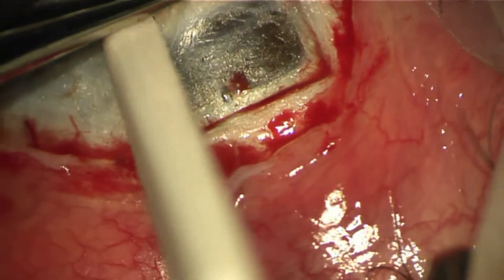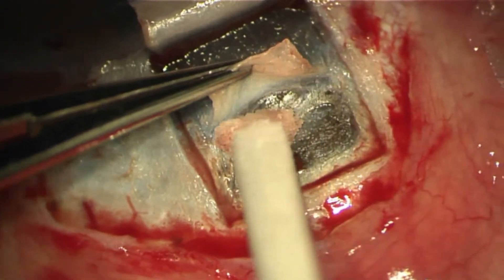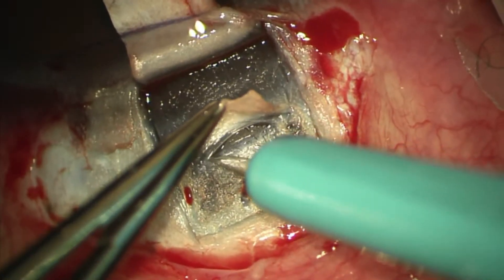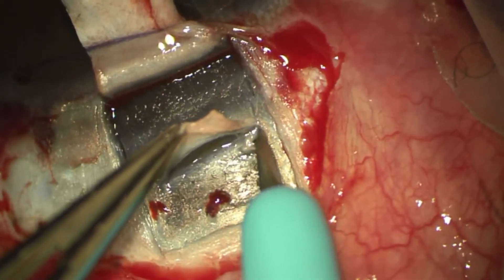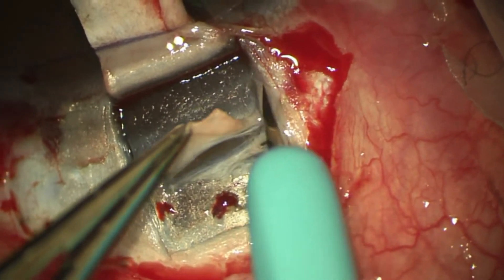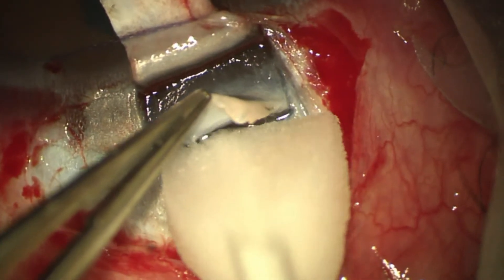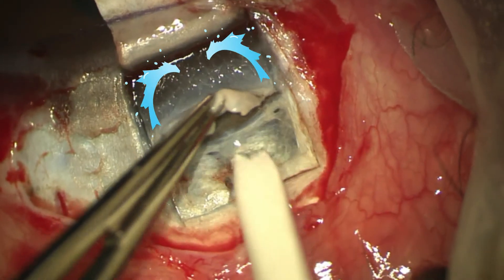At this point it is very important to avoid sharp instrumentation. We can switch to dry Weck-Cel sponges to bluntly dissect this area. If there are still some fibers on the sides of the filtration area, you can cut them with the super sharp to expand the trabecular-Descemet's membrane window.